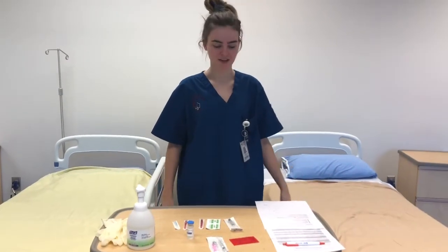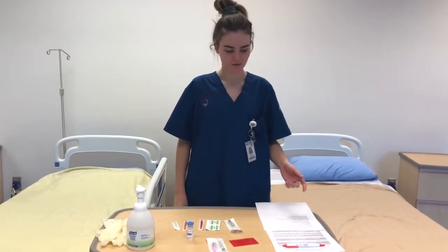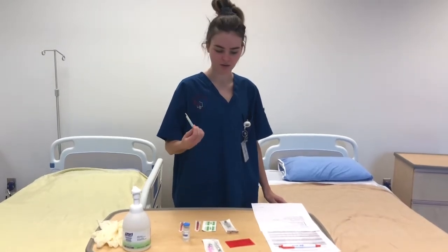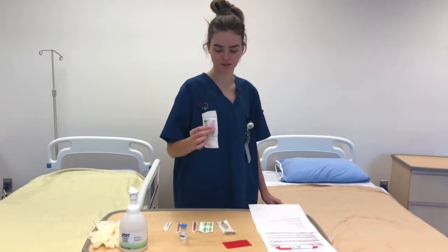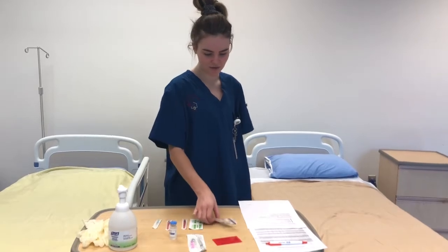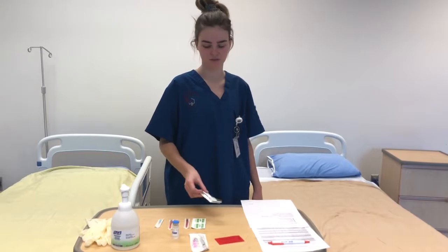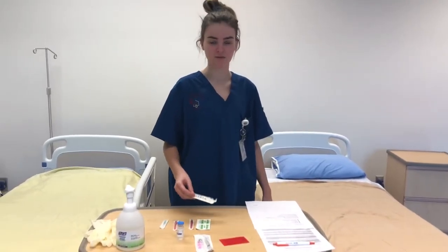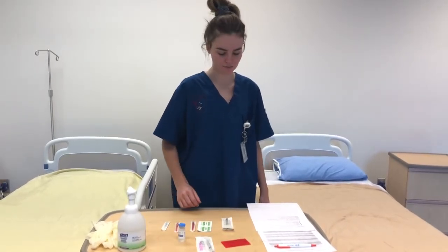Okay, so we were going to be giving a sub-Q injection and an IM injection. So for the injection to Mr. Mancini, for the sub-Q, the needle gauge is going to be a 25 gauge needle, and for the IM injection, it is going to be a 21 gauge needle. And for the syringe for a subcutaneous injection, we are going to be using a 3 milliliter syringe because we are giving him 1 milliliter, so it's the appropriate syringe. And that is the same for an IM injection, as we're giving 0.5 milliliters, and the appropriate syringe is a 3 milliliter syringe.